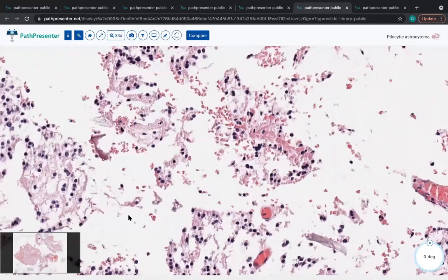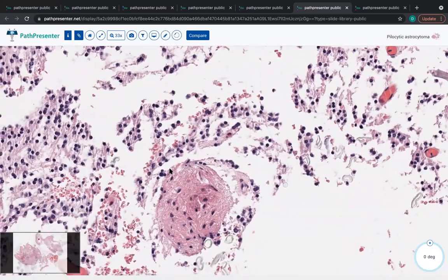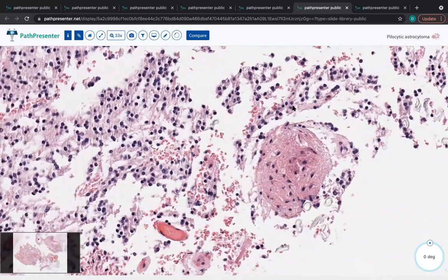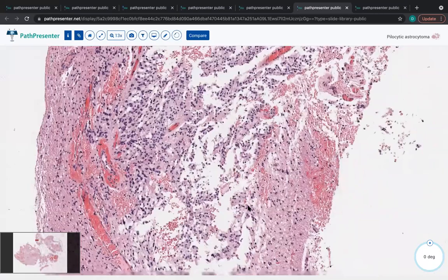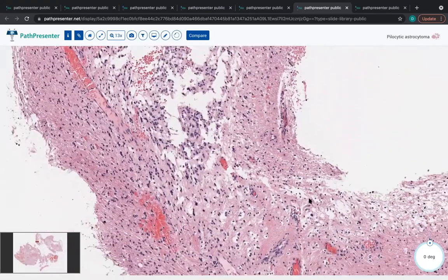Glioma with low-grade features. I mean, any of these kind of descriptive options are perfectly reasonable. I don't think any one is any better than the others as far as the surgical management goes. But occasionally one does run into tumors that look somewhat like this, but they don't otherwise fit that kind of standard clinical picture.